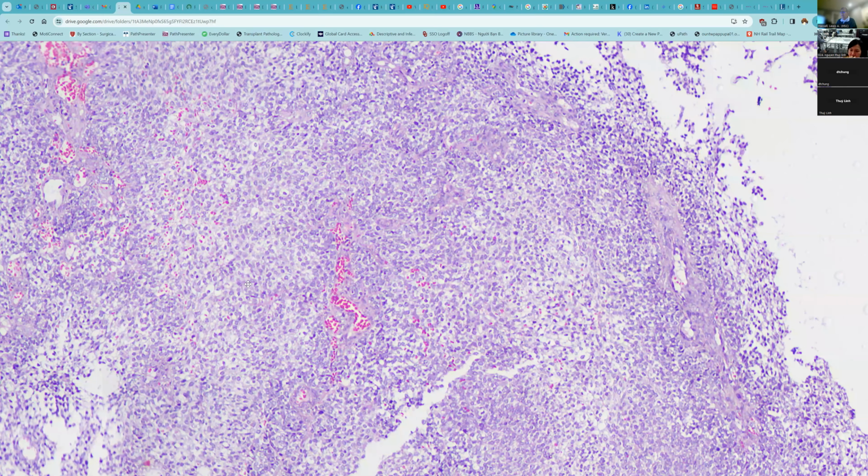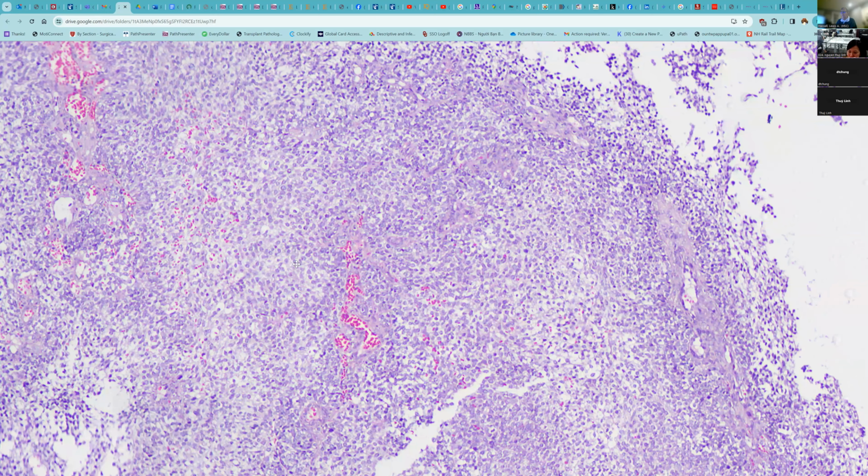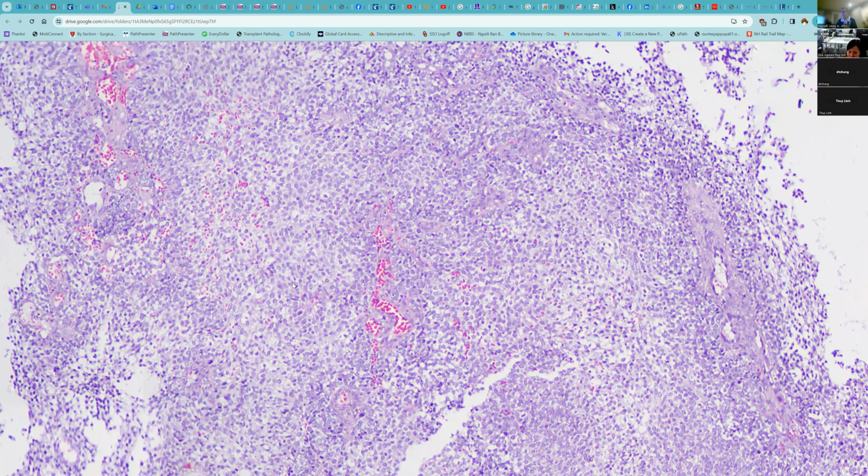So what would be a good consideration of immunostains for this tumor? Well, certainly cytokeratins to verify that it's carcinoma, neuroendocrine markers to rule out neuroendocrine type carcinomas. And then you want to do any of those markers that will identify the SWI/SNF loss, like INI1 or BRG1, preferably both, because it could be either one.